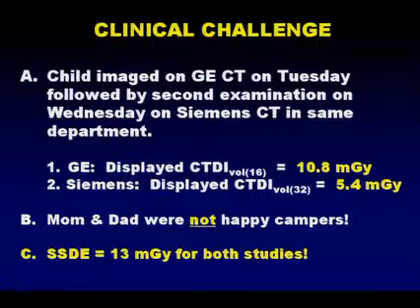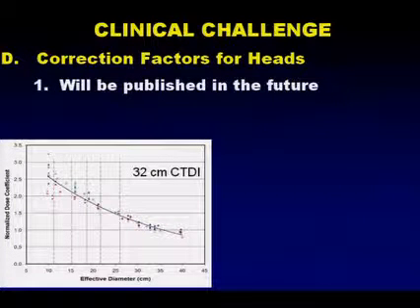When an SSDE analysis was done at the site, 13 milligray was delivered from both studies. And so the SSDE, of course, is a much better estimate of patient dose.